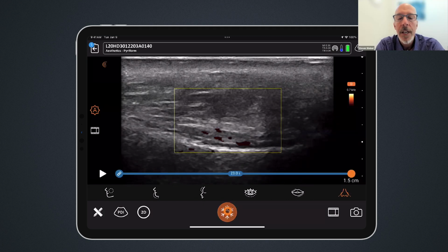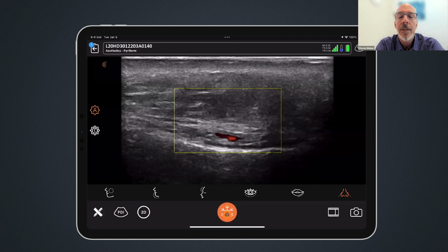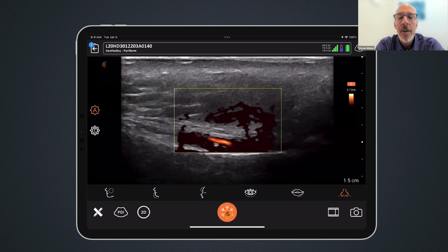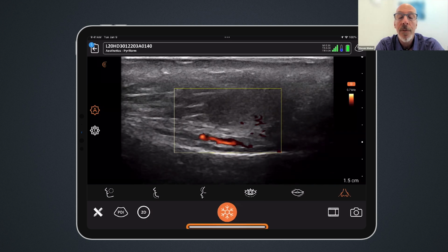So without even measuring it, you can tell that this patient's artery is too close to the bone for safety. Right. It's less than a millimeter away. So in this case, you need to either do it under direct guidance, which is a little bit hairy, particularly for the novice, or just decide to inject it with a large cannula more superficially than on the bone.